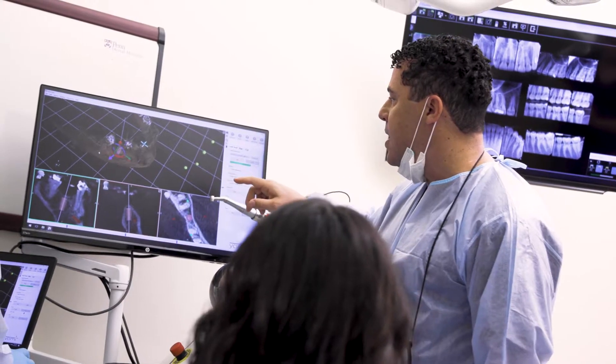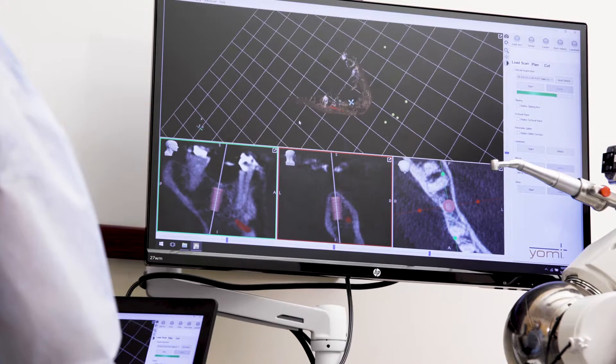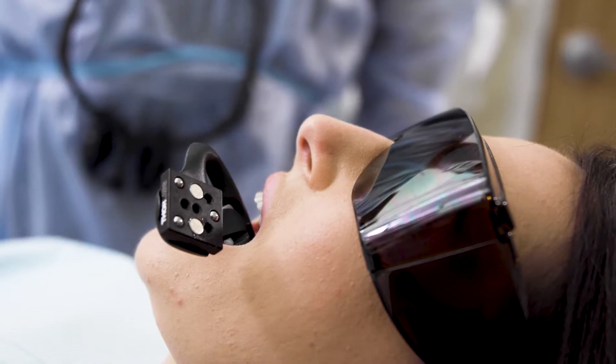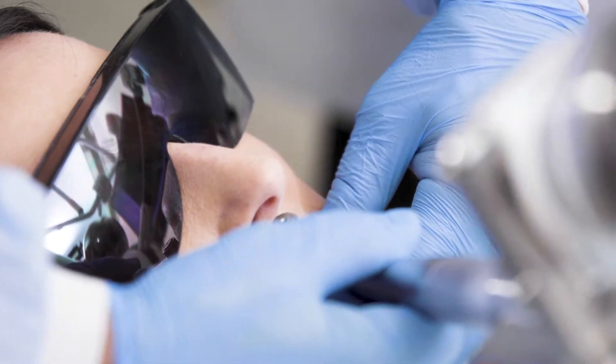Then we do the virtual plan — I'll check and make sure that everything is exactly where I want it to be. Then we'll attach the tracker to the patient's splint and check for accuracy.